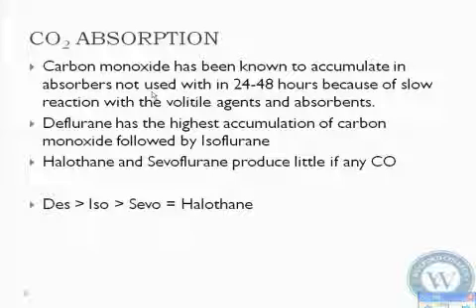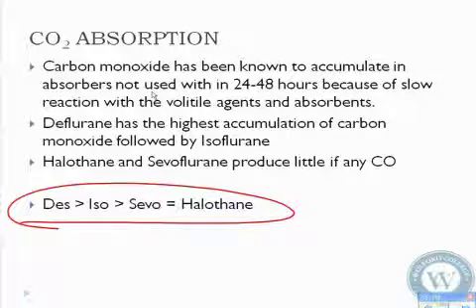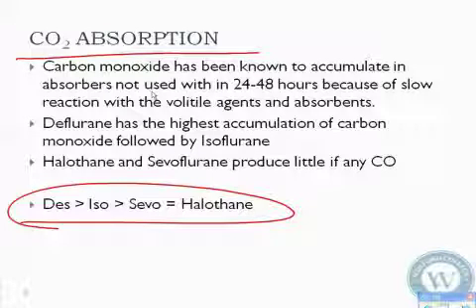All right. Know this too. Okay? So with your CO2 absorber, carbon monoxide can form with soda lime particularly. It generally doesn't, all right? But if you did have a desiccated CO2 absorber, or if you had an anesthesia machine that sat in a room for weeks and nobody used it and you didn't think to change it, then you could see some carbon monoxide form.